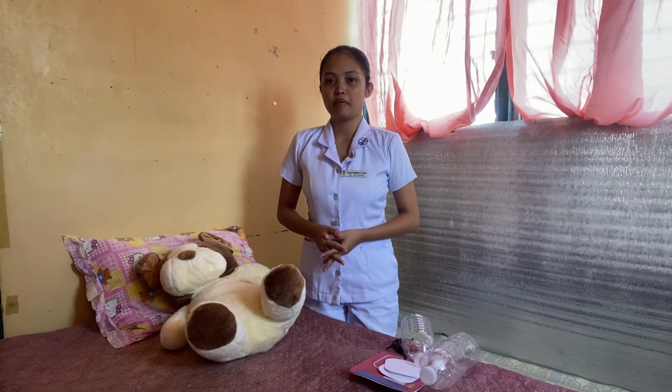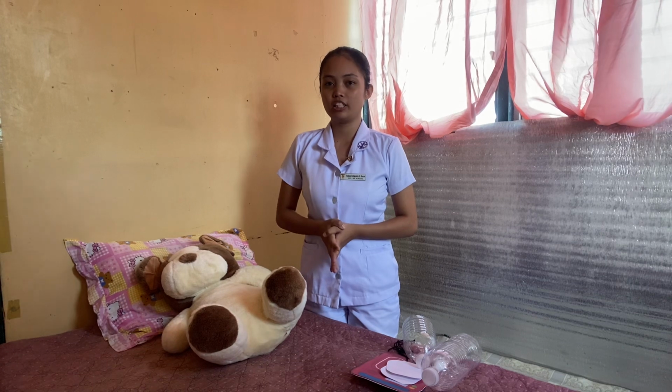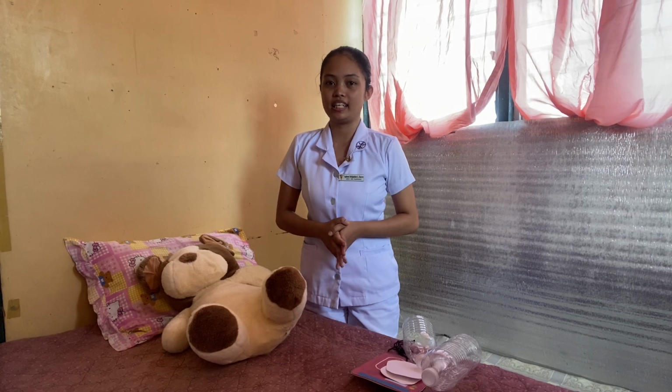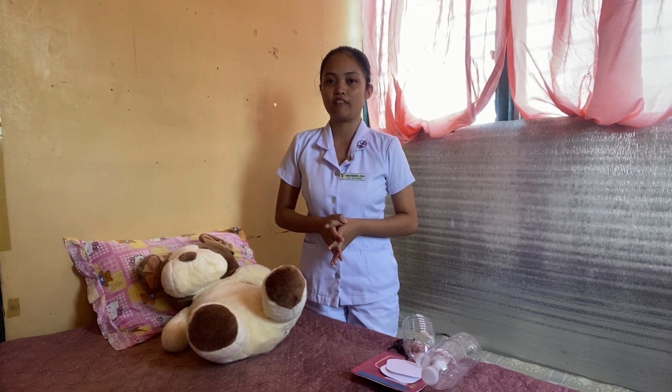Good day. I am Afea Rogelat Alvarez from BSN 12H, and now I'm going to perform the adult cardiopulmonary resuscitation and AED skills. First, I'm going to begin with the assessment and activation.